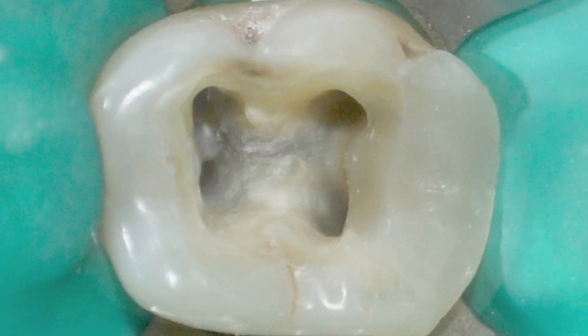Access cavity preparation is one of the most important steps in doing root canal treatment. It provides access for the instrumentation and obturation of the root canal system.